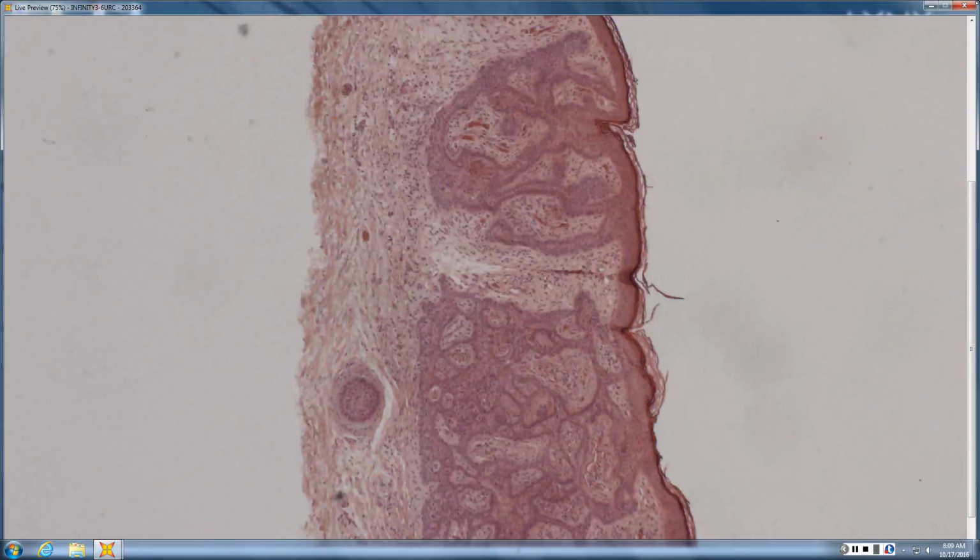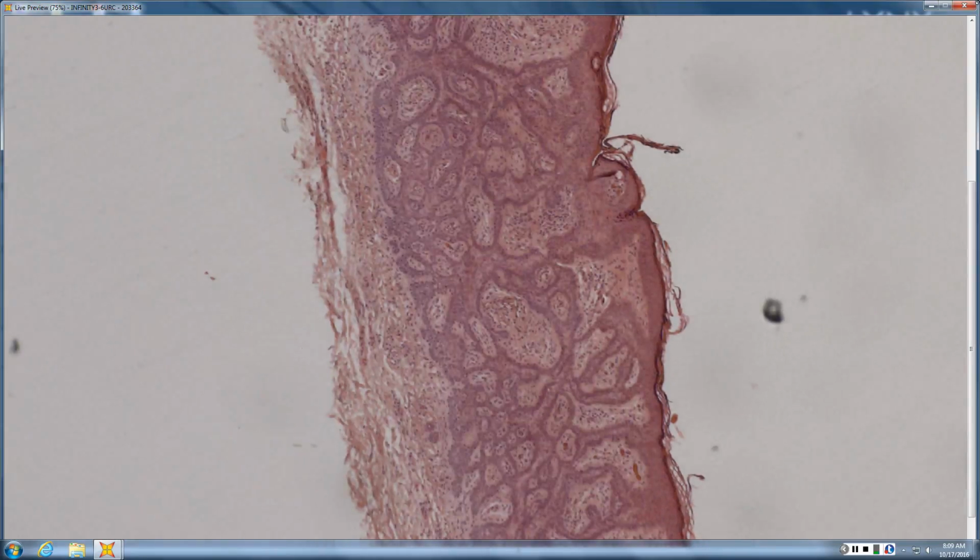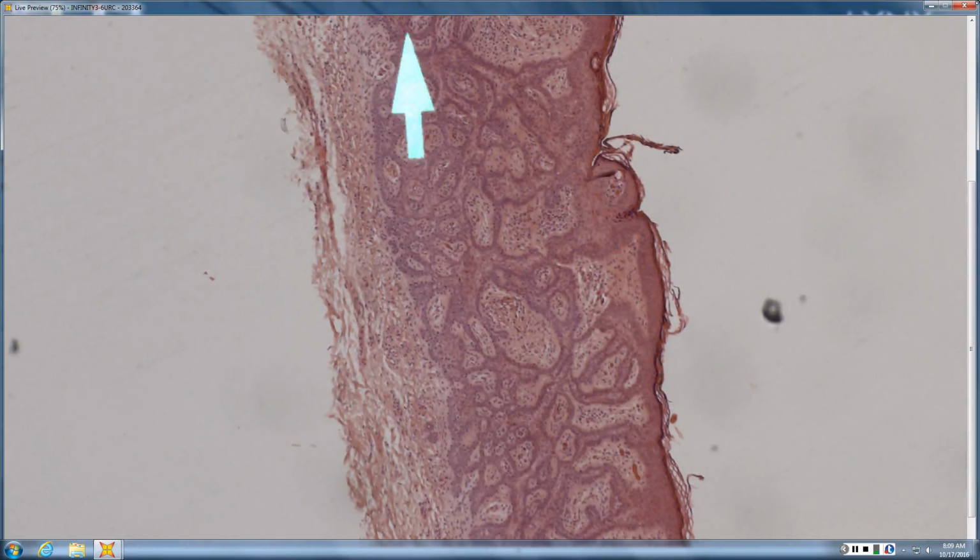Infundibulocystic basal cell carcinoma radiates outward from a central follicle-like opening. This is broader and is anastomosing bands and has a prominent fibrostroma in between. So, fibroepithelioma of Pinkus. Very good.